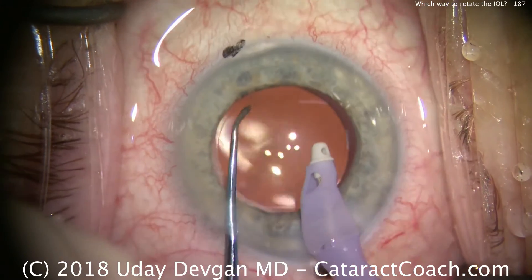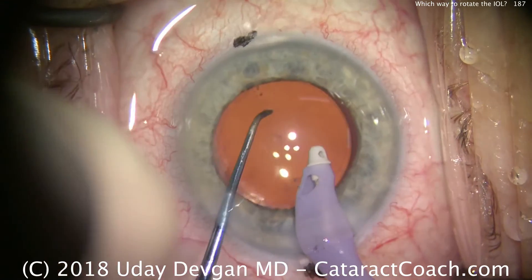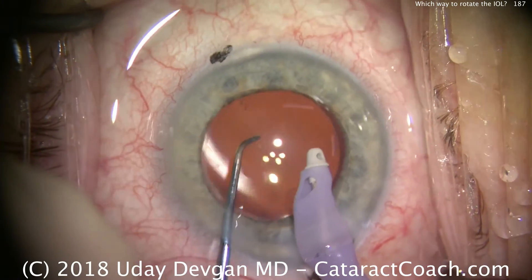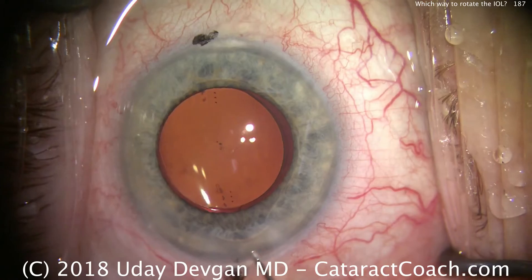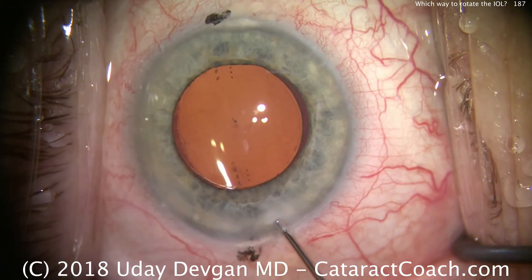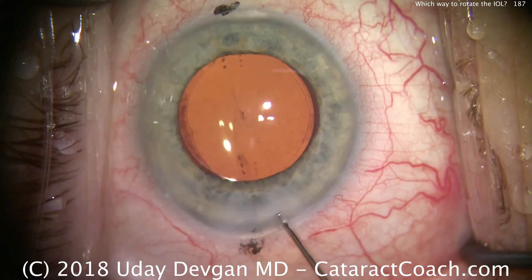So if the capsular bag is inflated with viscoelastic and the haptics are folded up, you can rotate either direction. But once you remove the viscoelastic and collapse the capsular bag, and once the haptics have unfolded, you want to go only in the clockwise orientation — to prevent the ends of the haptics from poking the capsular bag or getting stuck at the lens capsular bag equator.